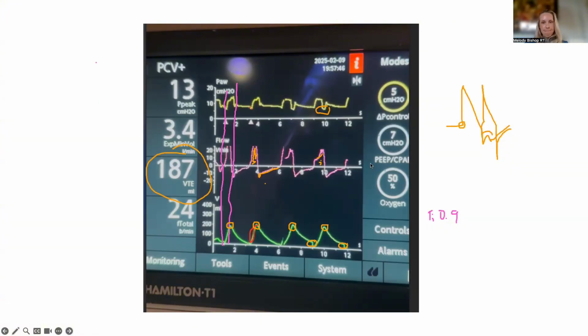Then the third thing is, in my situation with my friend who had COVID and was prone, it was a whole shebang, I just had to paralyze him, unfortunately, right? We hate to do that because obviously that's definitely not diaphragm protective, but we have to do what we have to do sometimes. But unfortunately, I think a lot of people were paralyzed in the face of reverse trigger when providers thought it was a double trigger situation. Whereas if you did some stuff with the ventilator, you might be able to rectify the situation. You know what I mean?